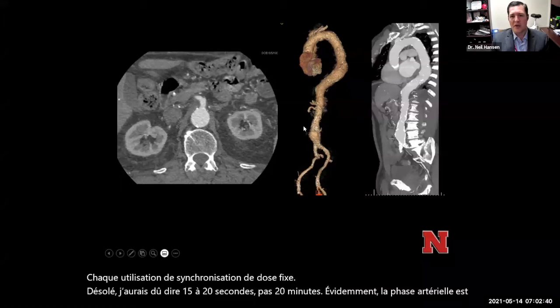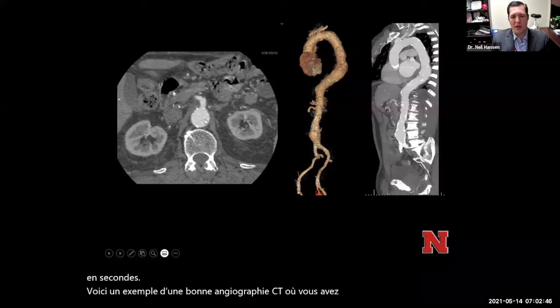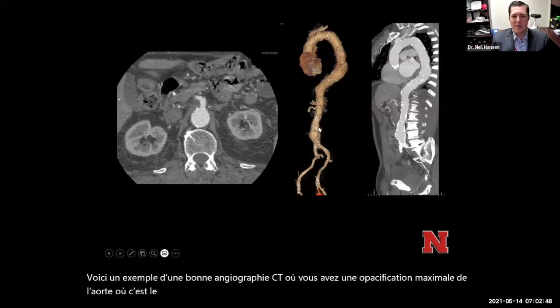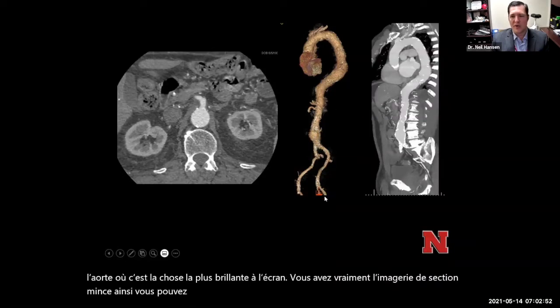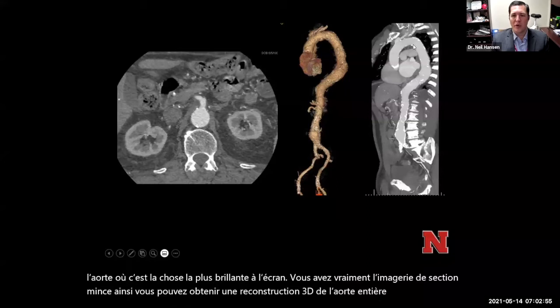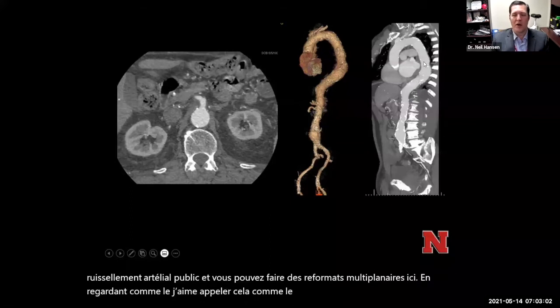Here's an example of a good CT angiogram where you have maximum opacification of the aorta — that's the brightest thing on the screen. You have really thin section imaging, so you can get a 3D reconstruction of the entire aorta and pelvic arterial runoff. You can do multi-planar reformats, like the oblique sagittal or candy cane view of the aorta in the chest.